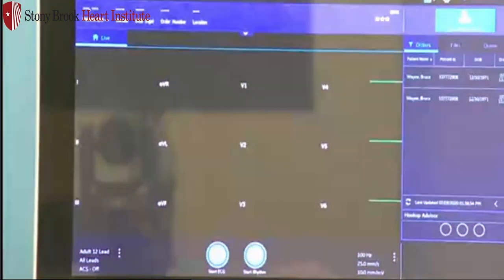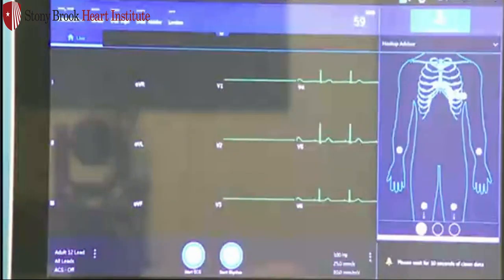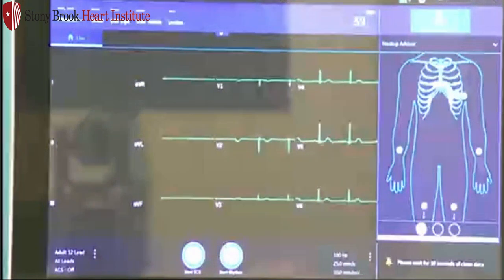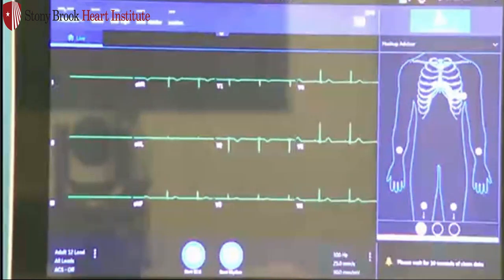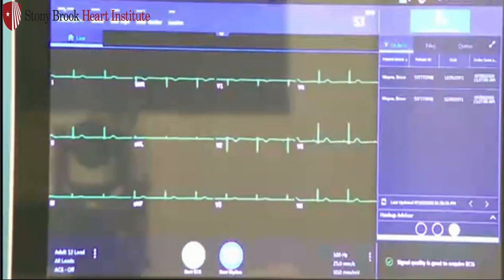Once in the system, I'll walk you through the new screen layout, and then we'll get into acquiring an ECG. At the top of the screen, you'll have your patient demographic bar. This will populate once you scan the patient information. In the center, you'll have your date and time. To the right, you'll have your heart rate and beats per minute.